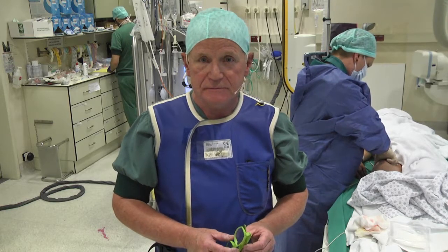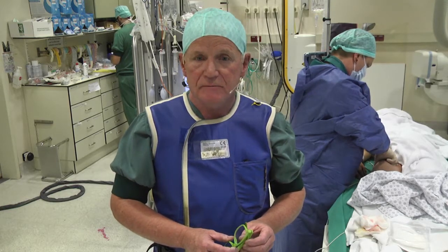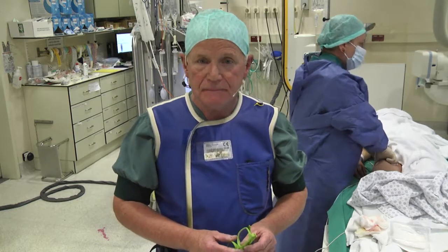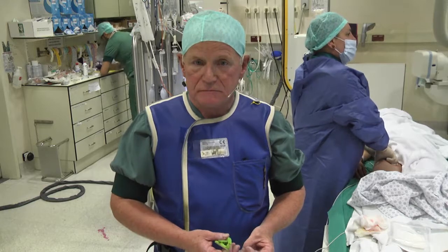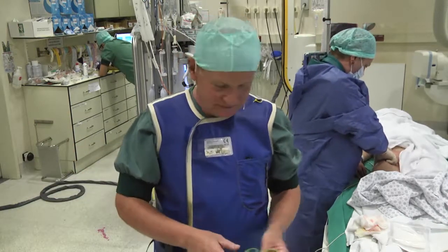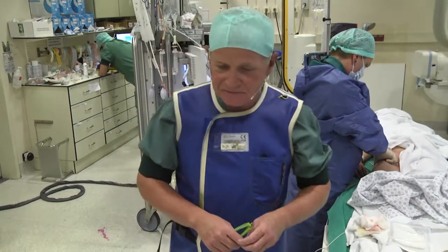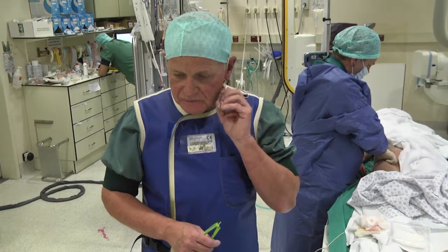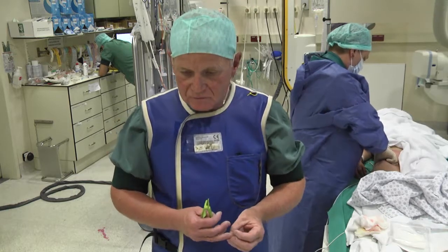Okay. Last question by Andreas. I would like to make a comment on the dry seal. I think it makes sense to have a 24 dry seal in the drawer, Mark. Oh, we have it in the drawer. If you have a problem with the melody valve, you can get it out through a 24 dry seal. So it makes sense for those who implant melodies to have a 24 dry seal in the drawer.